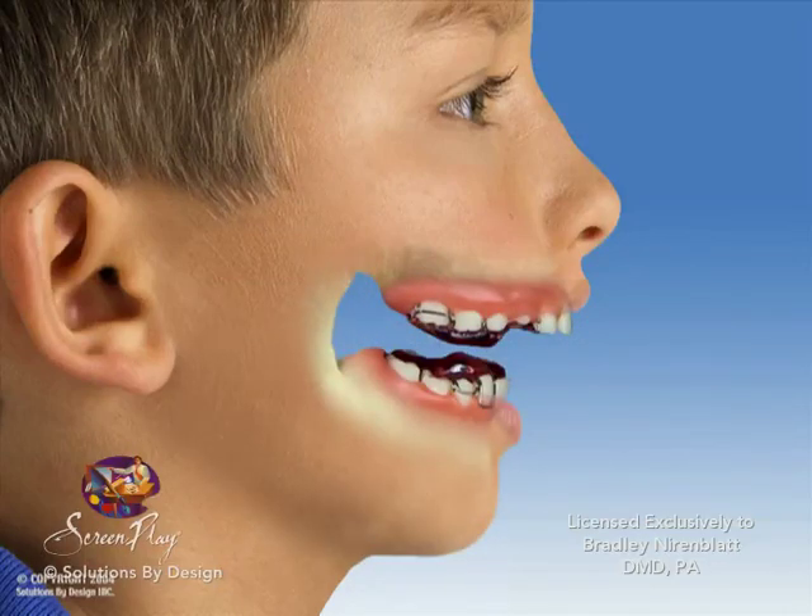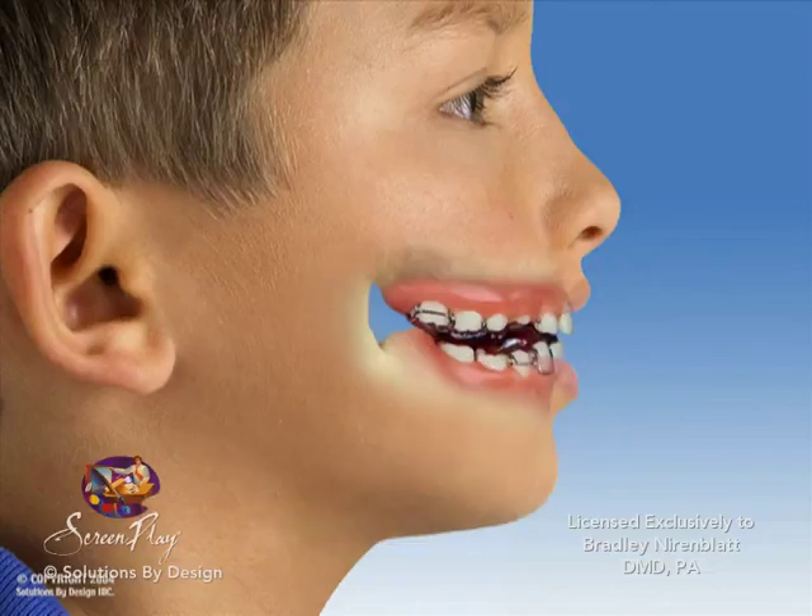As you bite, the acrylic of the lower piece impacts the upper piece, thrusting the lower jaw forward.